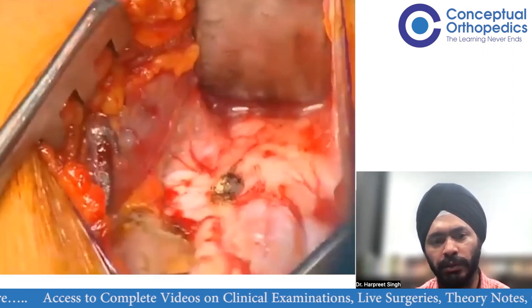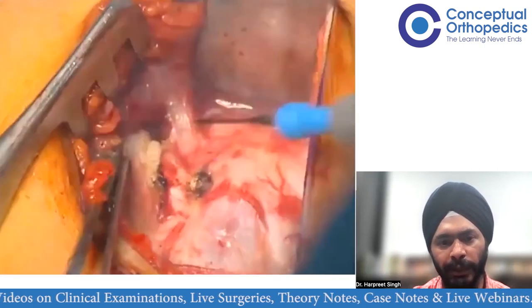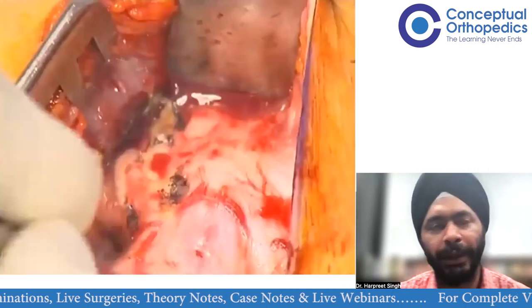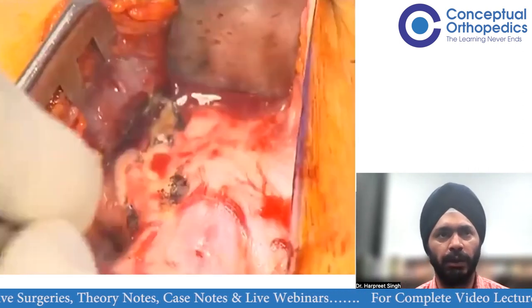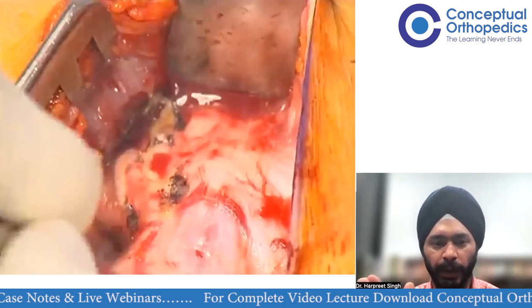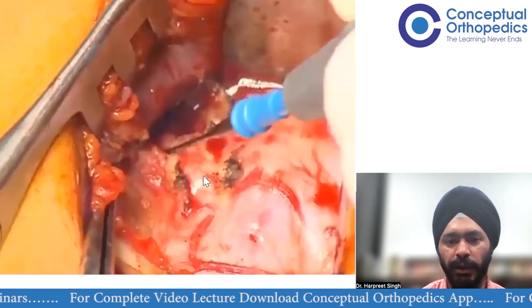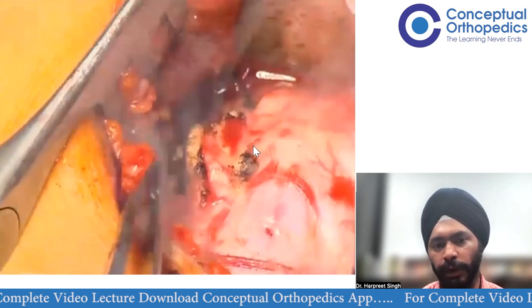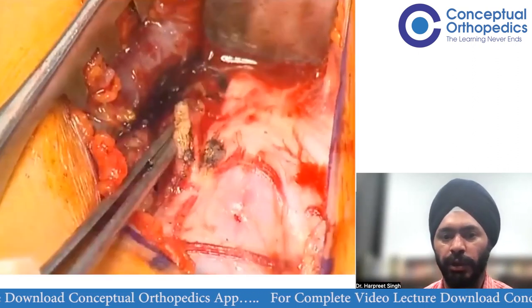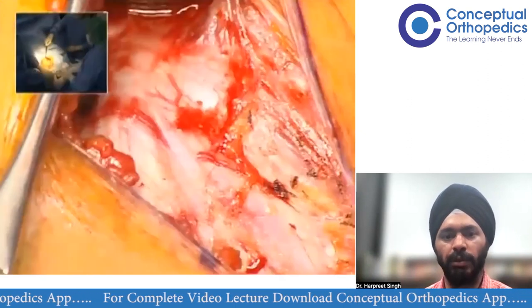You cut the coracoacromial ligament, leaving a part of it still attached to the coracoid. This retained portion of the coracoacromial ligament will help facilitate later closure of the capsule.